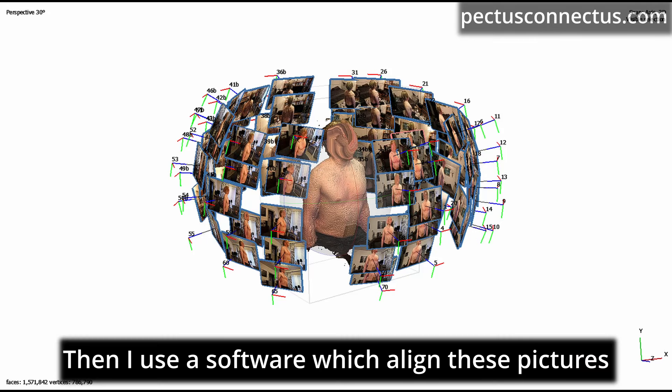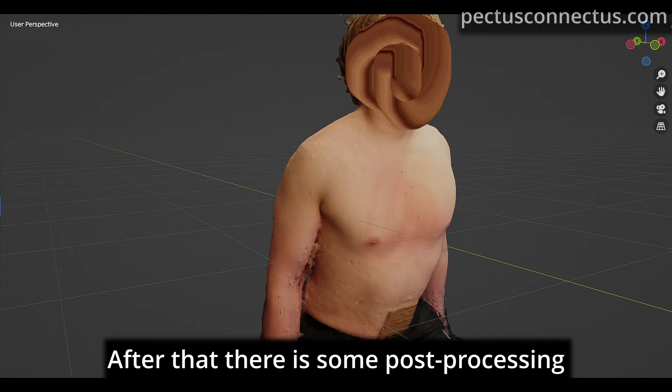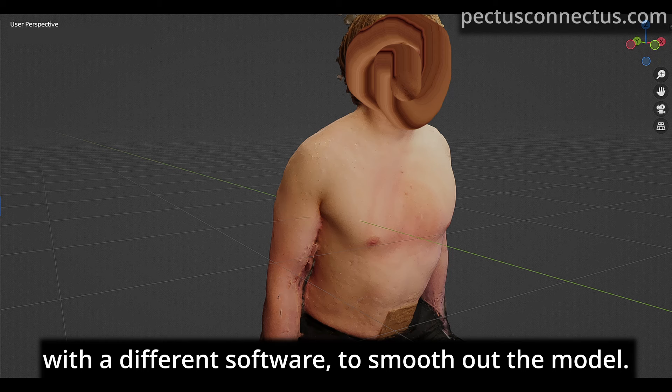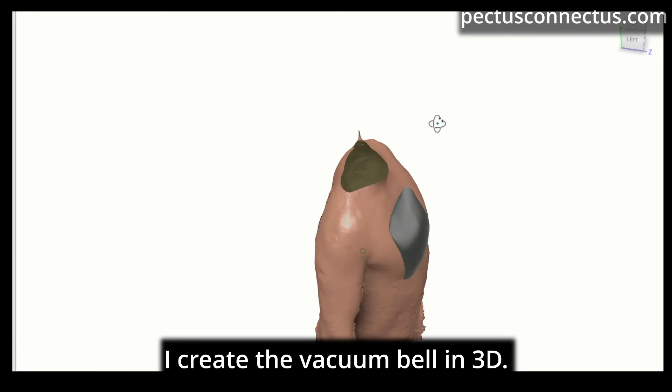Then I use a software which aligns these pictures and creates a 3D model of the client. After that, there is some post-processing with a different software to smooth out the model. And finally, with the help of a CAD software, I create the vacuum bell in 3D.